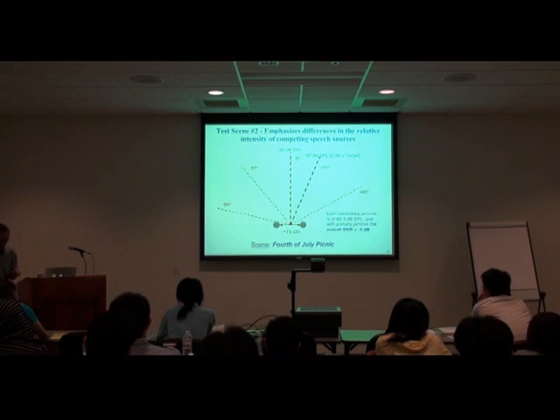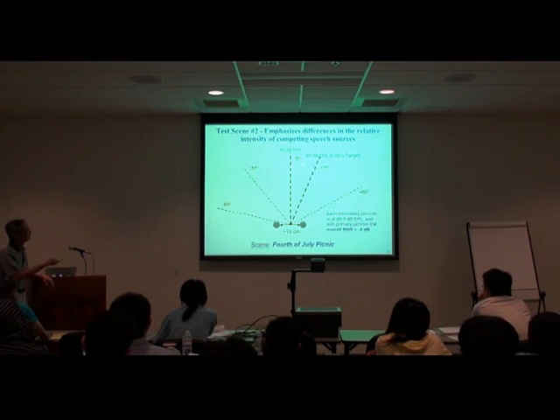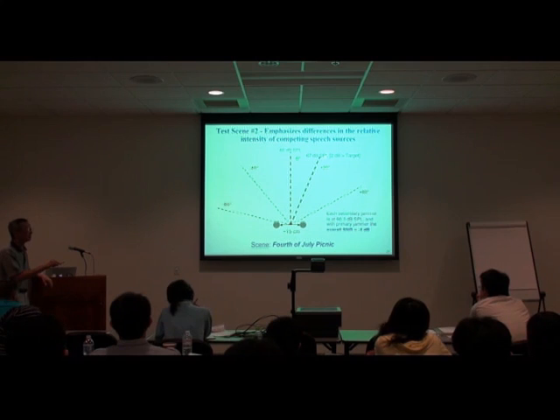This time we create a situation whereby next to the target sound, you have a signal that is very strong, stronger than the target signal. And this condition typically is hopeless, and usually that becomes problematic.